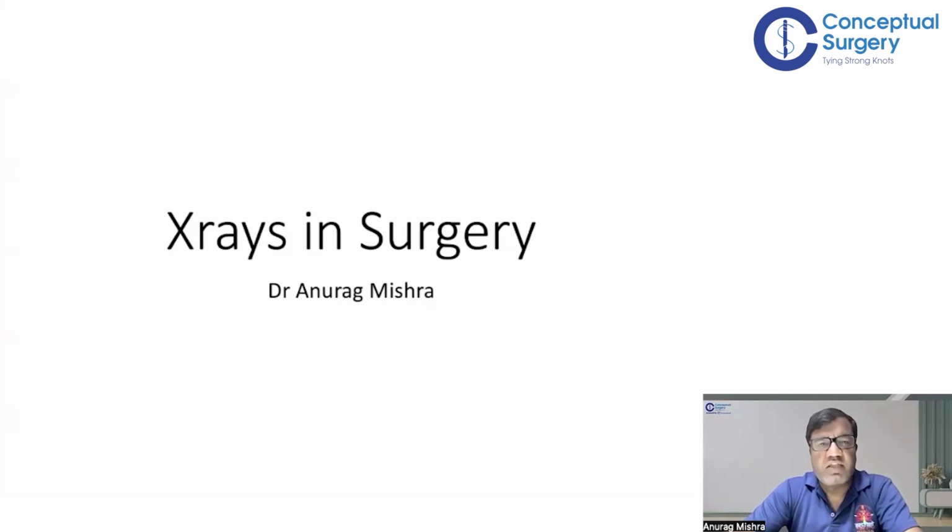And now we will start seeing the clinical cases and how to present, how to describe an X-ray, how to read an X-ray. And again, we'll be doing it in sections. So today we'll be doing plain X-rays. Then we'll have a video on X-ray with contrast, and then another one with special investigations, which will include CTs and MRIs and mammograms and other special investigations.